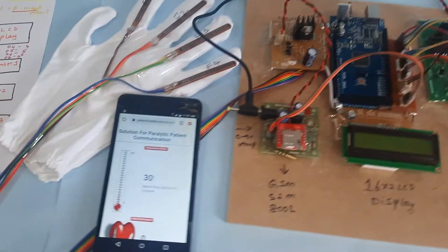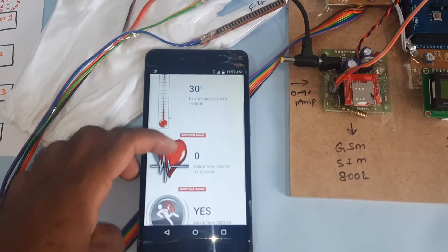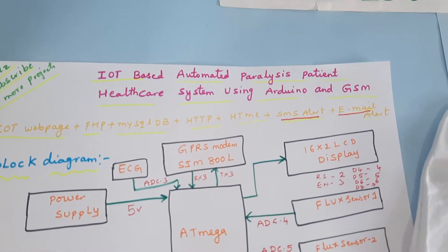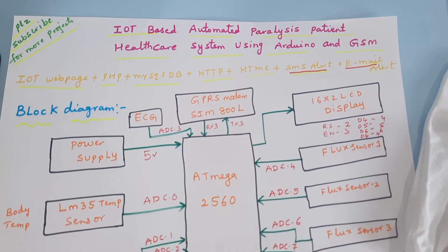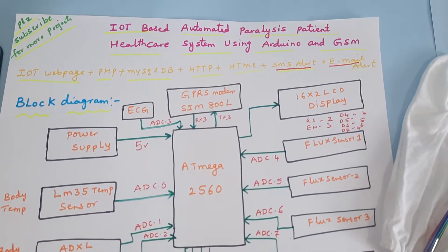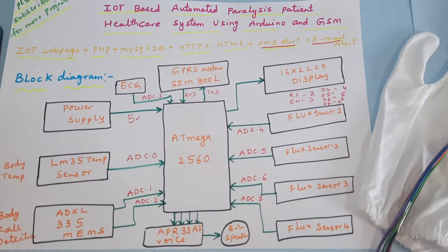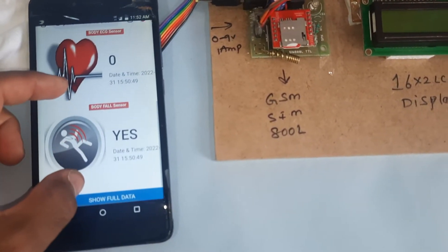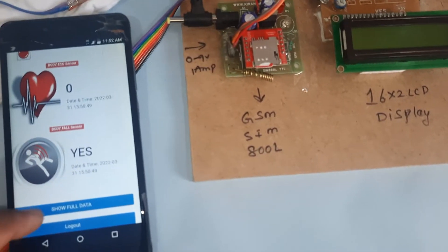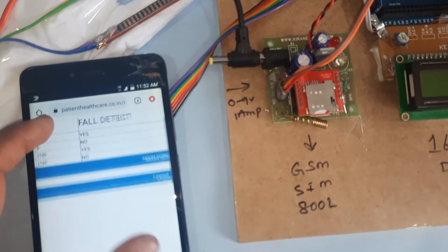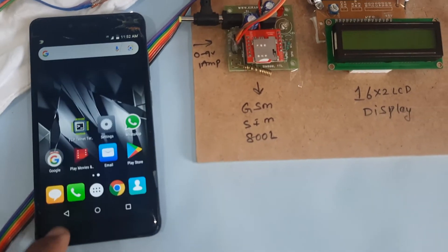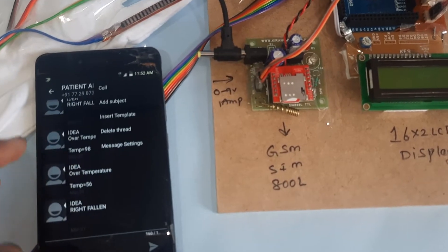Hi, we are from SVS Embedded. The project title is IoT-Based Automated Paralysis Patient Healthcare System. We are using an Arduino and GSM/GPRS modem. We have one IoT webpage showing temperature, patient fall detection monitoring, and ECG.